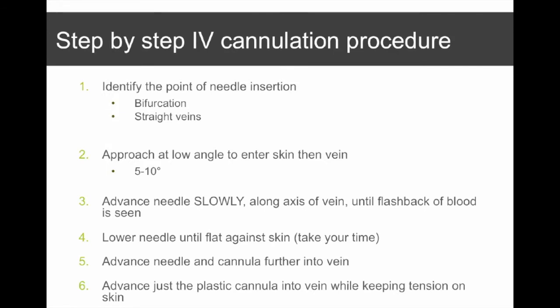So I first of all try to identify the point of needle insertion, and often it can be difficult depending on the vein, but bifurcations are very useful spots to access, as well as straight veins. Now, this doesn't mean that you can't access veins that are tortuous, it's just a little bit more difficult and probably needs a bit more expertise. I then approach at a low angle to enter the skin and then the vein, and roughly 5 to 10 degrees is kind of angulation that I require.